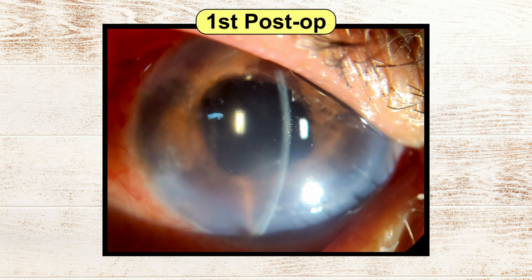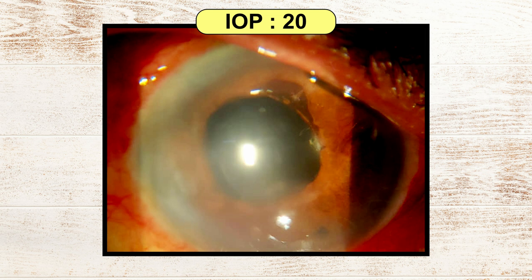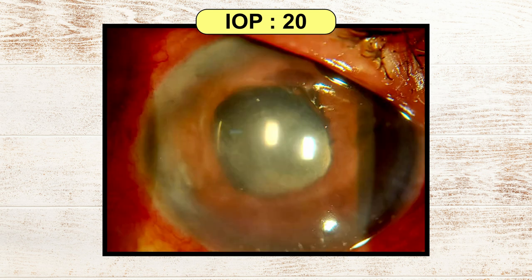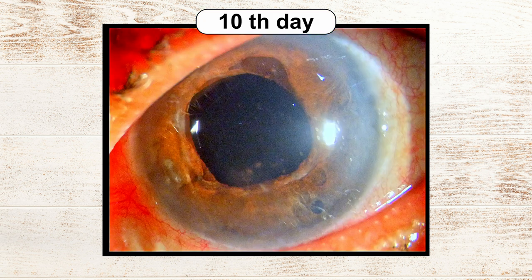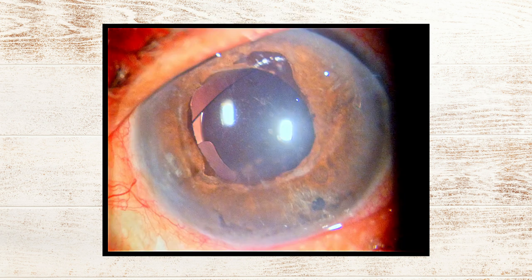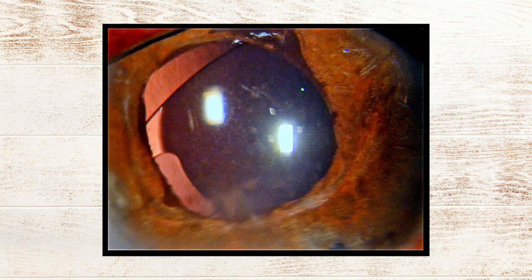These are the first day post-op pictures. The cornea was steamy on the first post-op day but there isn't any evidence of inflammation. Pressure was around 20s. With time, the patient's vision improved and we have been monitoring her with OCT macula at every visit. The cornea is clear and the macula, as of now, looks to be quite healthy. The pressures are normal and she's doing fine.